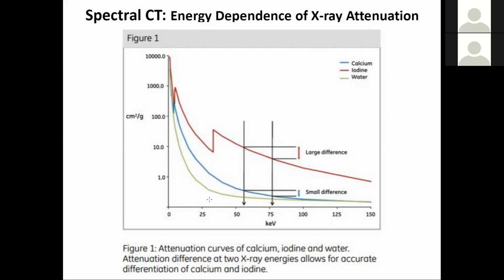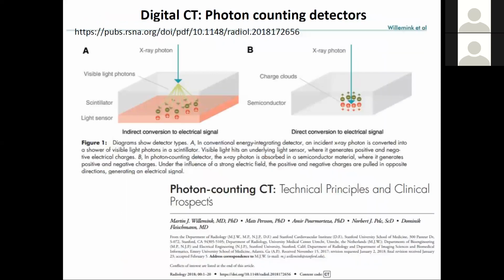So the idea is that the change in the attenuation coefficient with energy makes a bigger difference with the higher Z. Okay. Sorry about that. I didn't quite get my narrative going there, though I had intended.